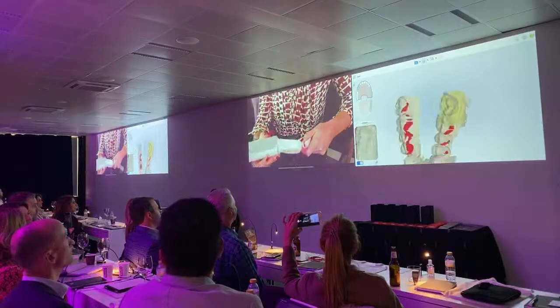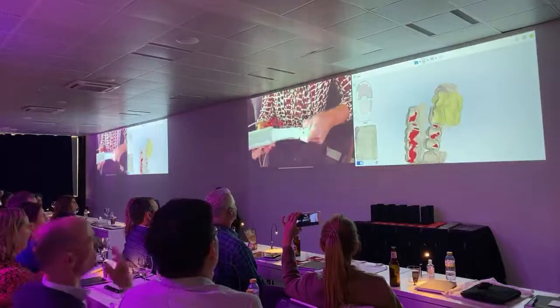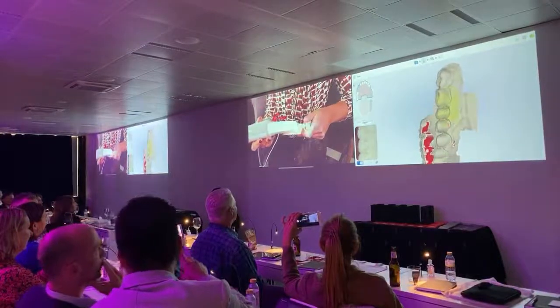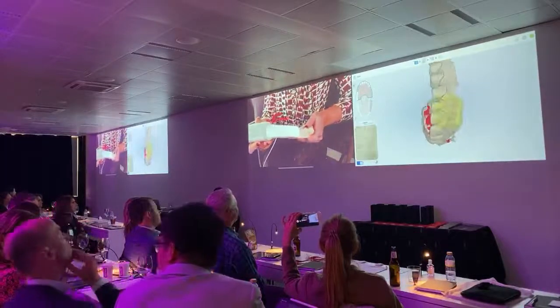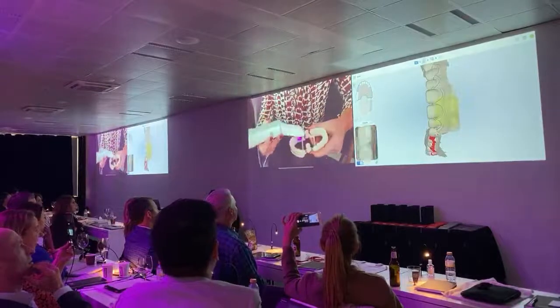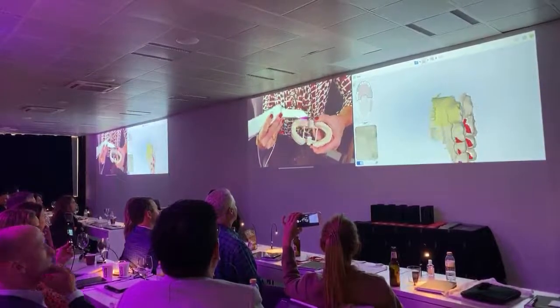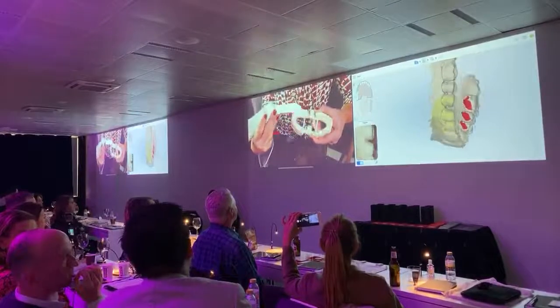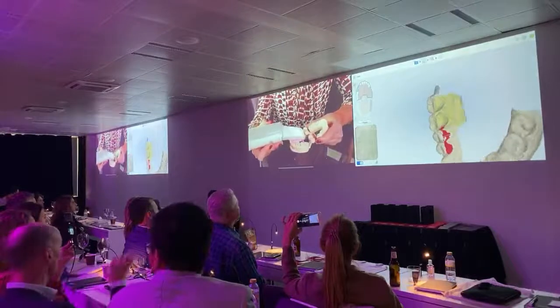And then you go buccal. And when you're going buccal, you do this pendular movement because you are copying the intraproximal area at the same time. This will make you faster. And then you go to the other side, occlusal, and then vestibular, and go the movement of the wave, like a wave. And then you go palatal, and do the same movement.